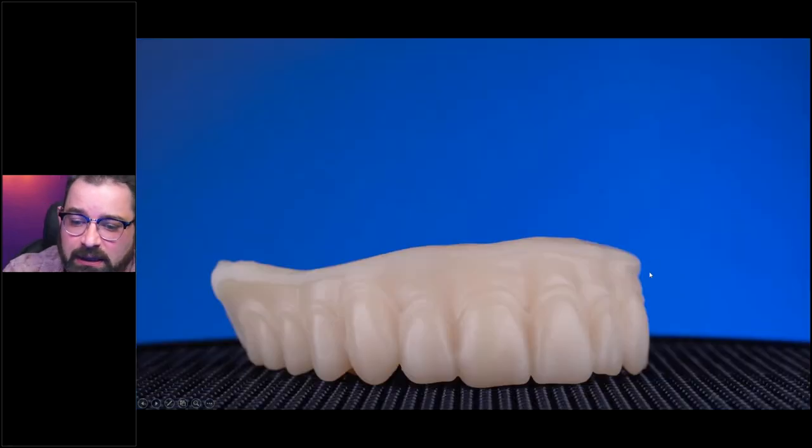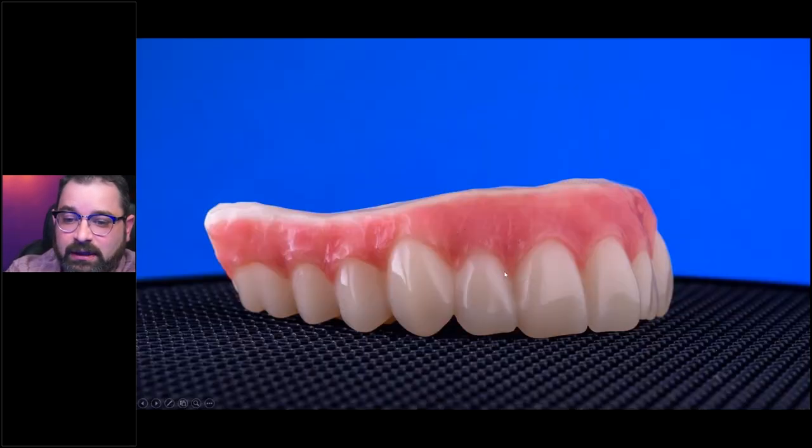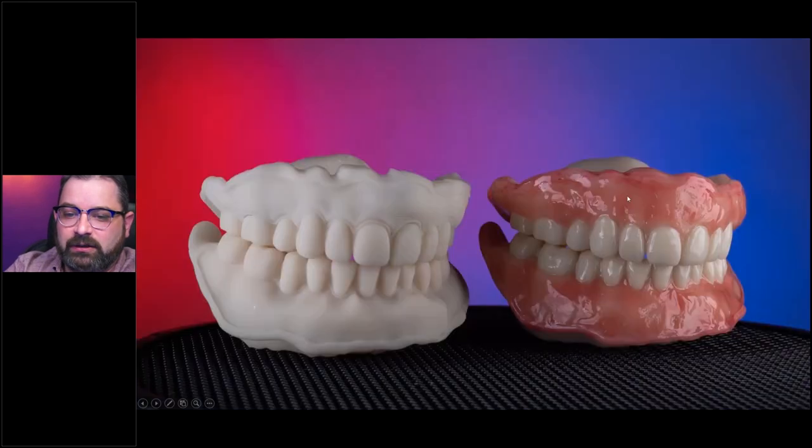For this hybrid prototype, I get patients where we're not sure about occlusion or aesthetics and we want to give them something to try out. In this case, I printed a restoration, cut it back digitally, smoothed it out, and layered composite on it. The patient wore it for about two months, and then we moved on to create a more permanent type of restoration. It's a fairly easy way of getting the results you want.